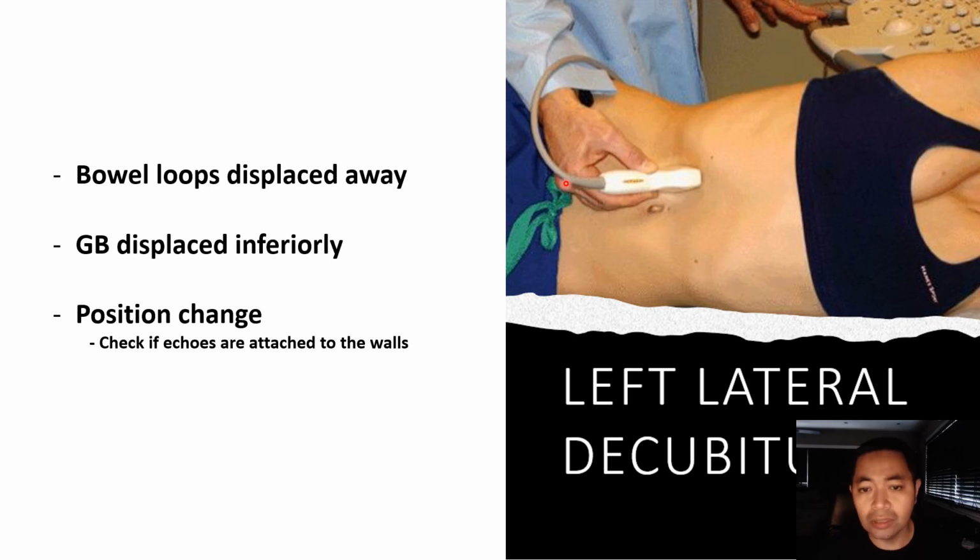Moving the patient into a different position would also permit one to see if intraluminal echoes within the gallbladder are attached to the walls or not.